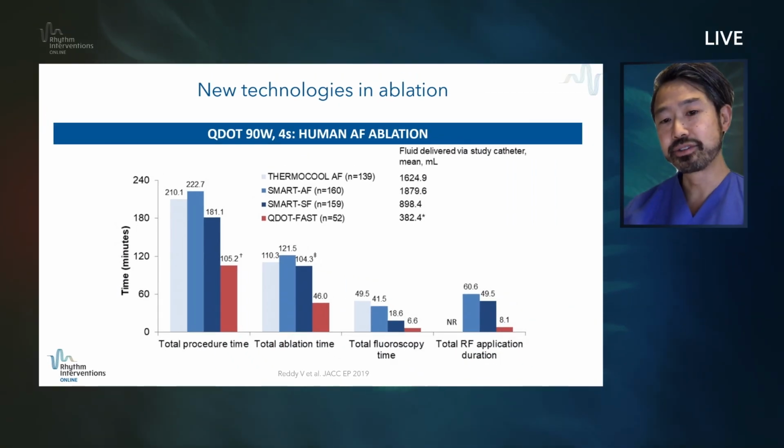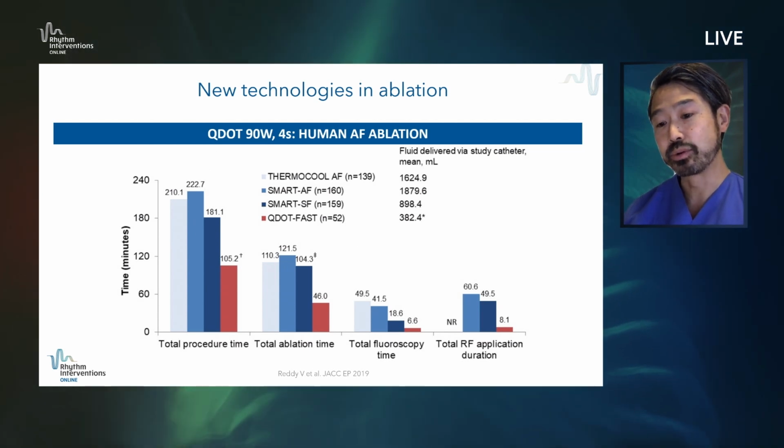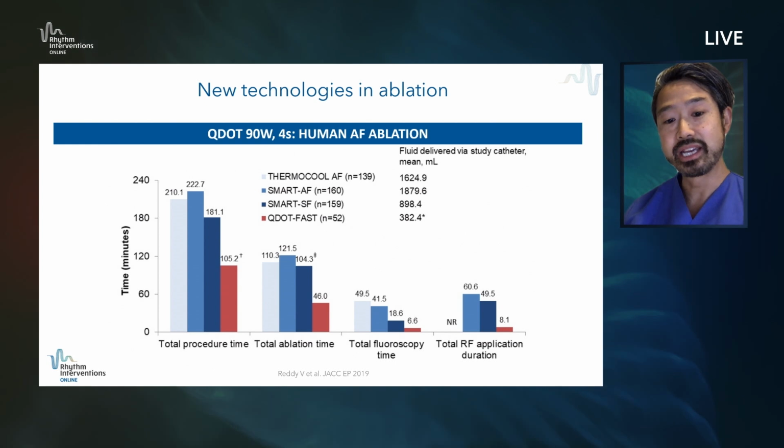The Q-dot also demonstrated in initial human experience in a more systematic fashion that it was able to reduce procedure time, total ablation time, total fluoroscopy time, and total RF application duration down to 8 minutes in this work by Vivek Reddy and co-workers.